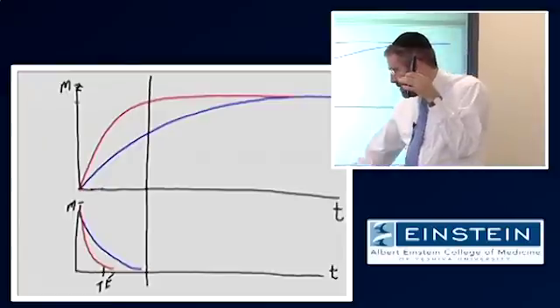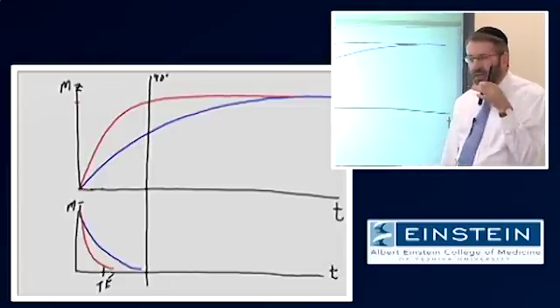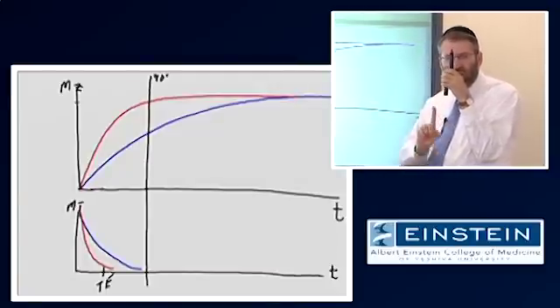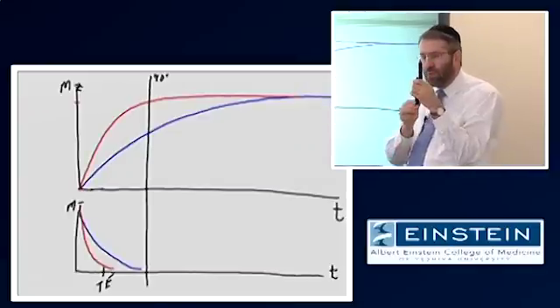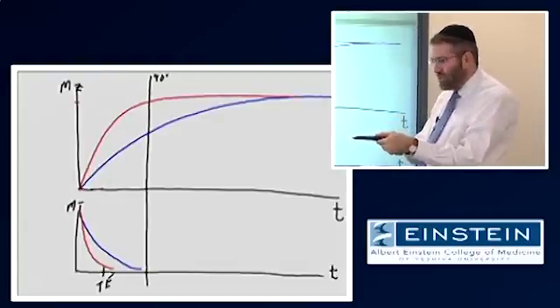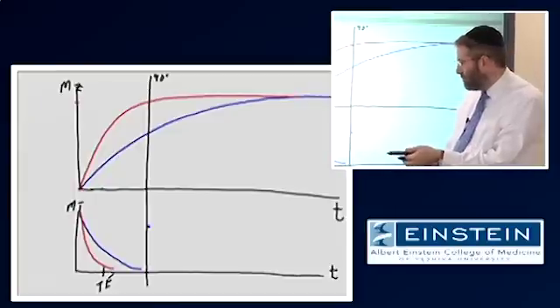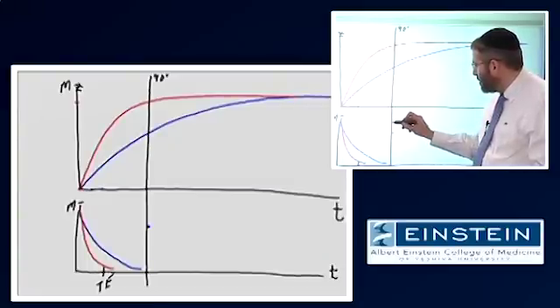Well, if we start again, which means that we're going to give a 90-degree RF pulse once more at this point in time, the only thing that we are able to rotate with that 90-degree RF pulse is the component of magnetization that's parallel to B naught, that's in the longitudinal direction. That's what we have up here. So when we give our 90-degree RF pulse, this is what happens. And what that means is that at our new starting point, we have this much signal from blue, maybe that's CSF, and we have more signal, not quite as much as over there, but a bit more from red.